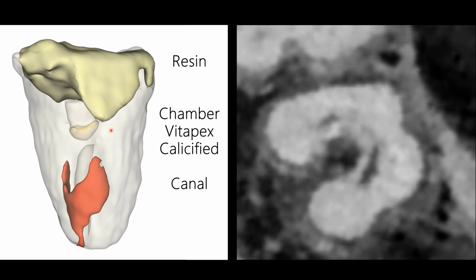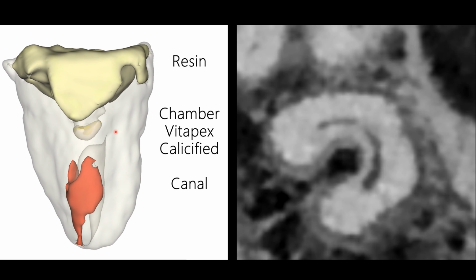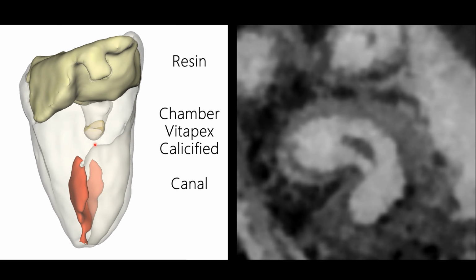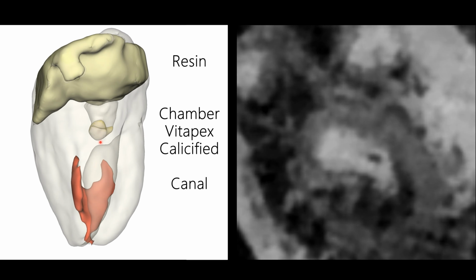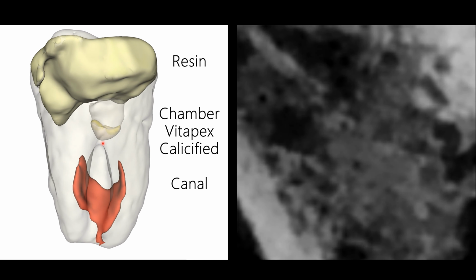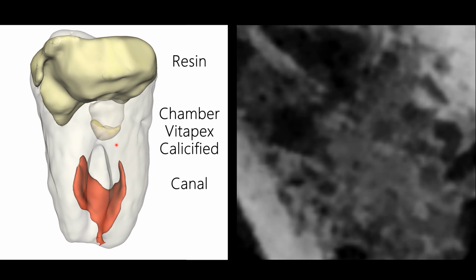So I sent the patient to take a CBCT, after I put Vitapex here, and that's obvious because I almost perforated here. It is less than 1 millimeter. So that means I could stop in time, because I am a specialist. I have been trained for this, so I know what I cannot do. I cannot find the canal, so I need a CBCT.